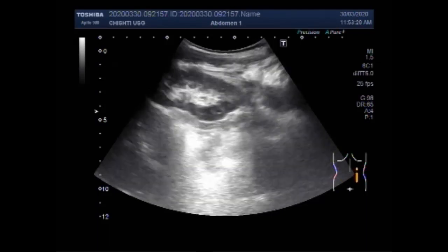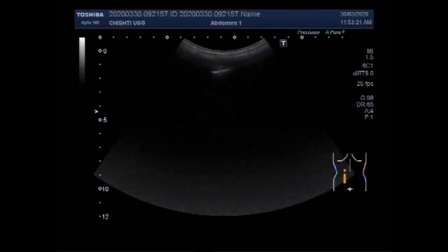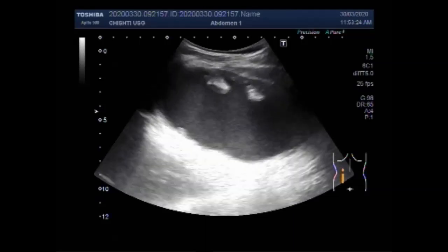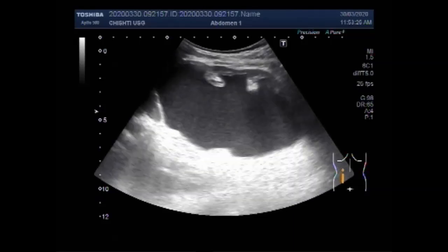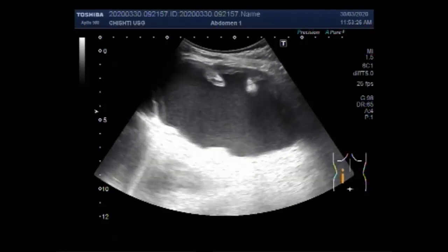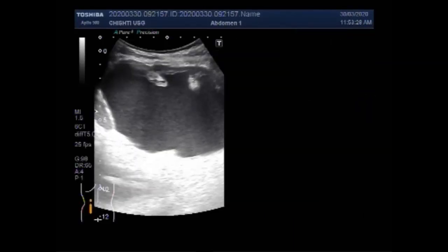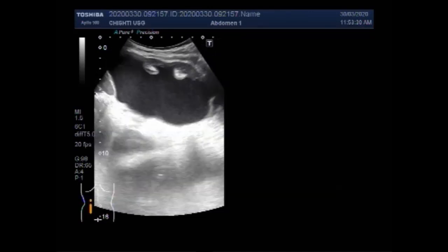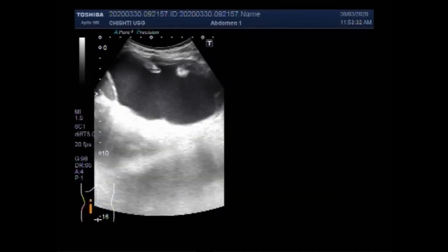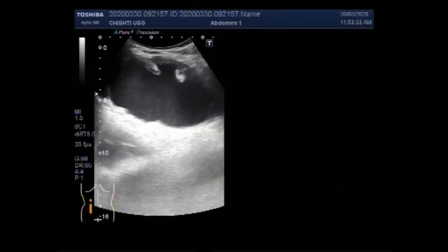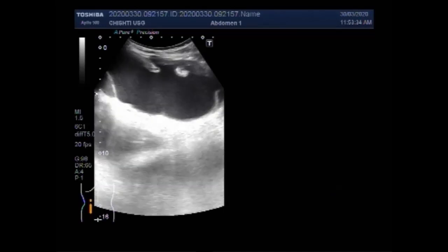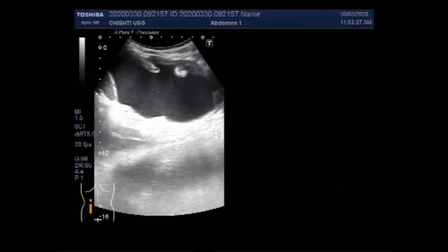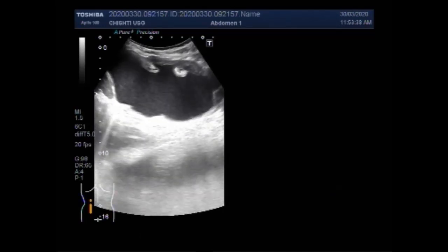Again, you can see the right kidney, which is echoarchitecturally normal but shows compensatory hypertrophy. This is the left kidney, and you can see the thick sludge floating in the fluid present in the dilated pelvicalyceal system of the left kidney.